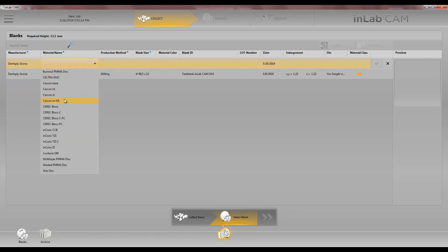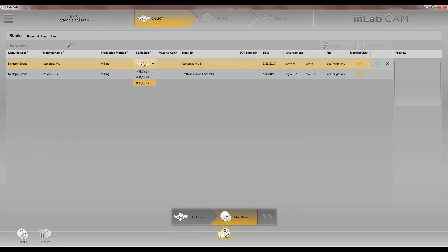Choose Circon XT multi-layer, choose our size of our disc, enter the enlargement factor — and you'll find all this information on the top of the disc.